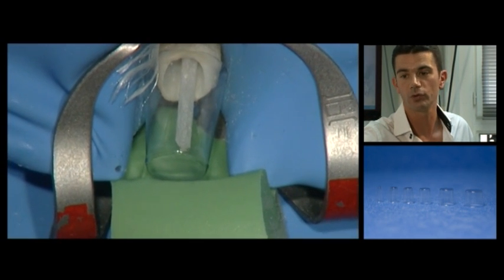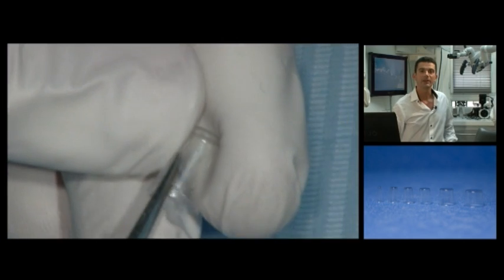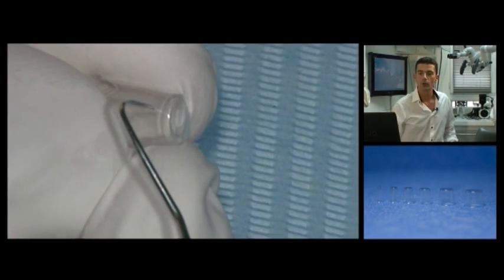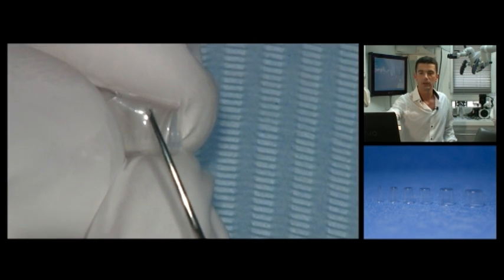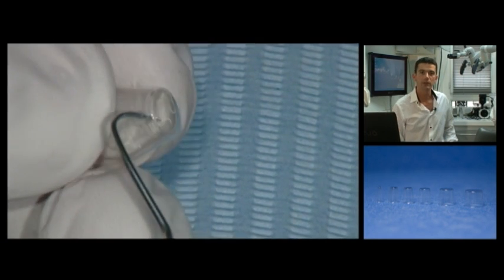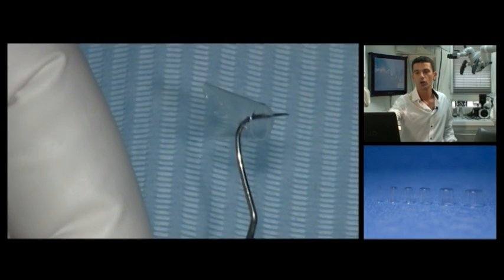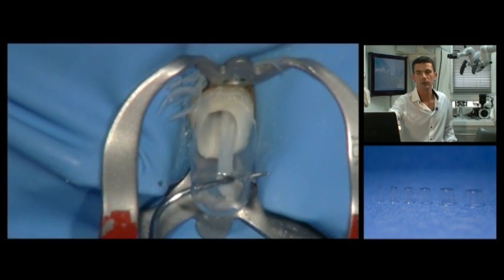This vestibular view shows the whole setup. The matrix is cut to fit the gingival festoon. Drain holes will also be made from the proximal side to avoid any compression of the material afterwards. The assembly is once more checked in the mouth.